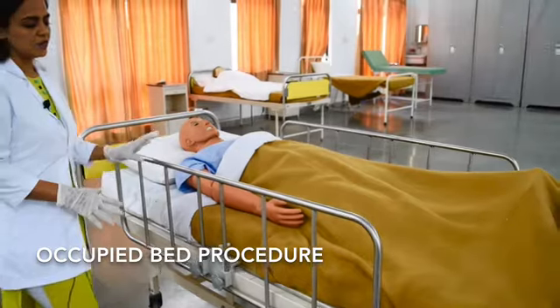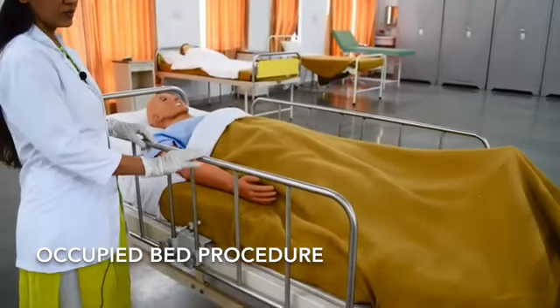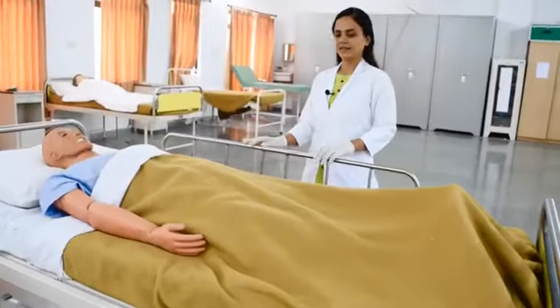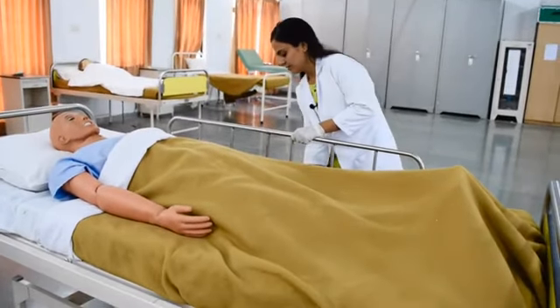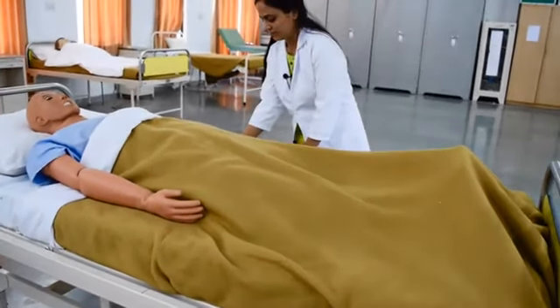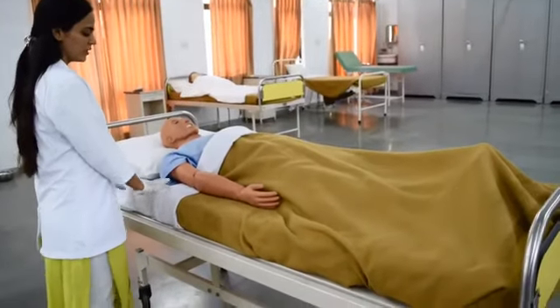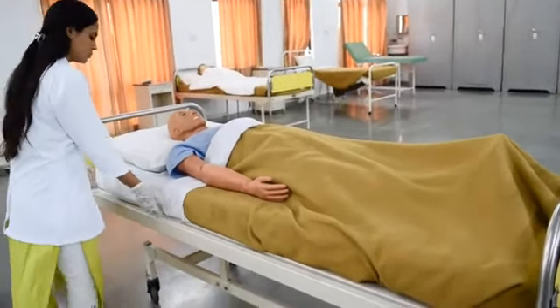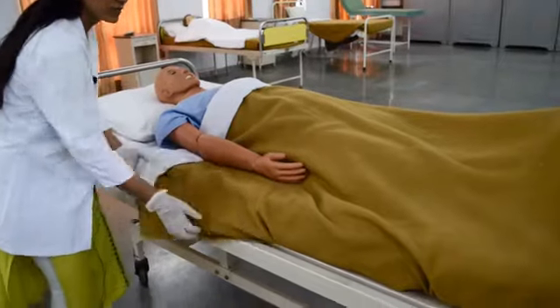First of all, the railings on both sides we have to push down, right? Here also we will push down these railings. Now we have to loosen these linens from both sides. So one by one we will loosen them.